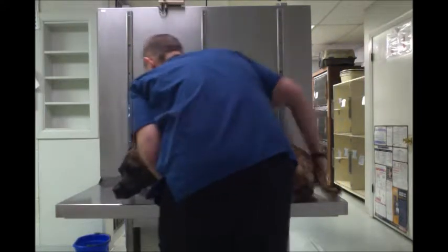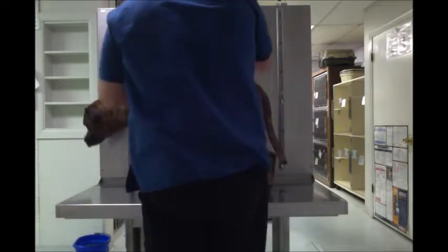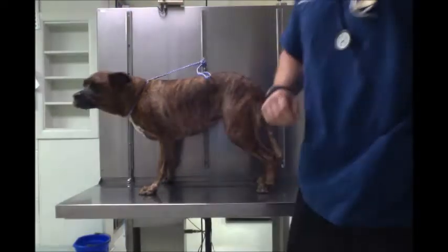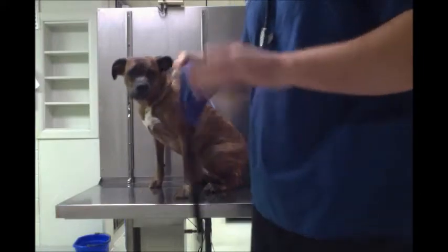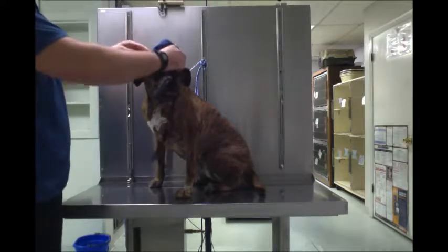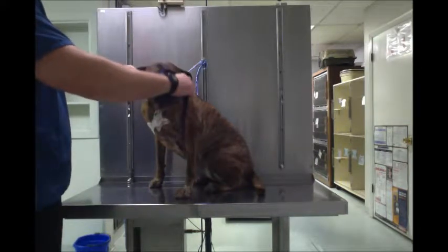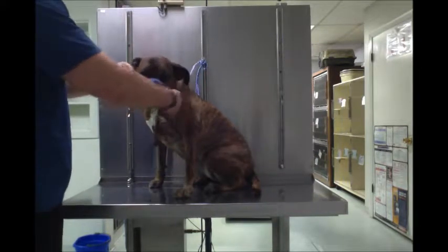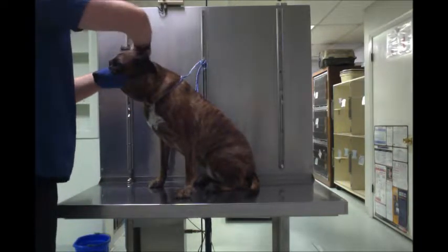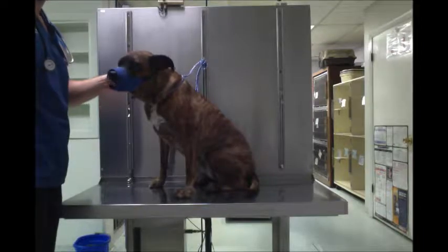Okay, next thing we're going to do is apply the dog muzzle. So we've got my muzzle here. With Lacey it's going to be very easy, she's very nice, but a lot of times you'd have to kind of play a game with the dog, just kind of get him to feel it, and straight onto her muzzle like that. And we clip it on, and she is properly muzzled.